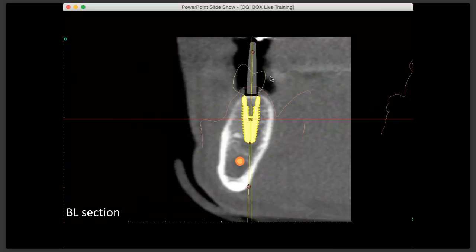You don't have to. You can use a denture tooth for a single molar, not a problem. Use a denture tooth and submit the model, or create an actual wax-up. It's really up to you. For single missing teeth, between teeth, you can definitely use a virtual wax-up, and I explained this in the previous videos in this module.